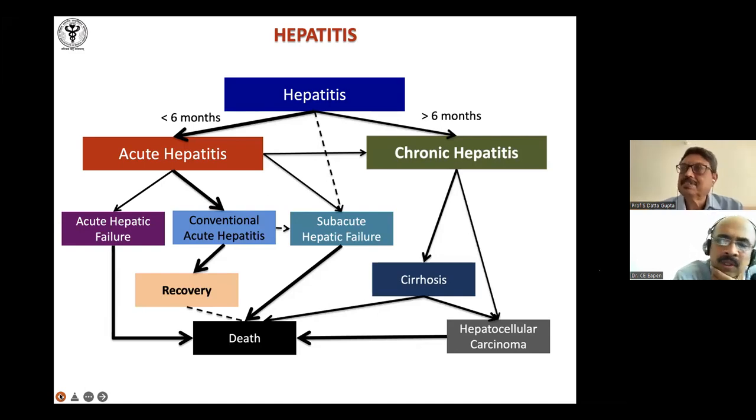Dr. Priyanka Kumari has asked, why not rely on the Rappaport system rather than the Kiernan system? Yeah. In fact, most of the biopsies now will tell you about zone 3, zone 1, zone 2. Textbooks talk about zone 1, zone 2, and zone 3 more than the usual periportal, centrizonal, or midzonal areas. You are right. That's what is being followed in most places now.